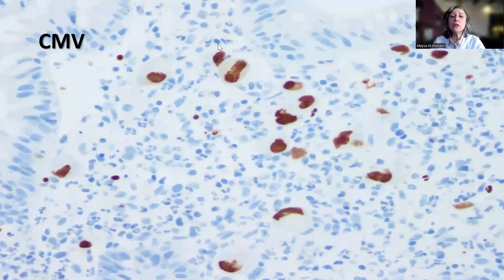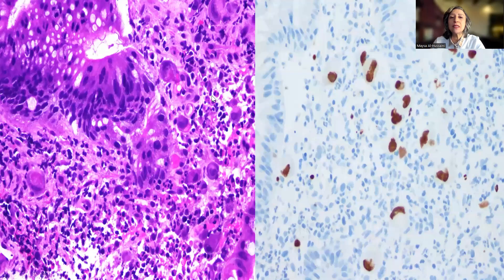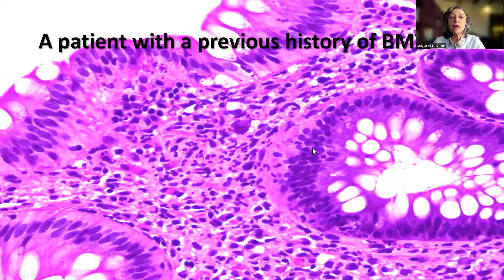This is the CMV immunostain, and all of those large cells — even what looked like the signet ring appearance — all stain positive with CMV immunohistochemistry. Usually it is a nuclear stain; sometimes you might see some cytoplasmic staining, but essentially it is a nuclear stain. This is just to contrast the H&E with the large cells scattered among the inflammatory infiltrate and then the CMV immunohistochemistry.